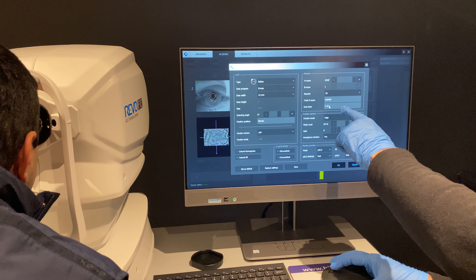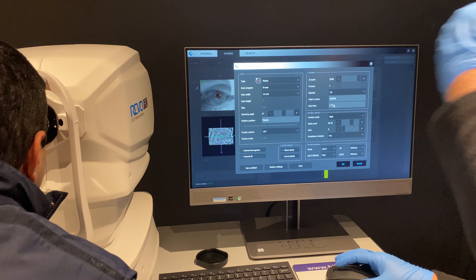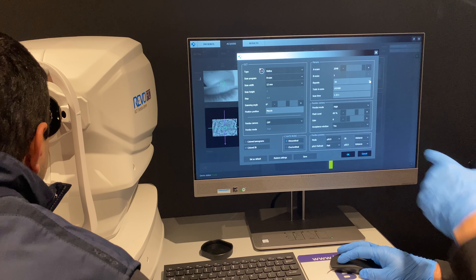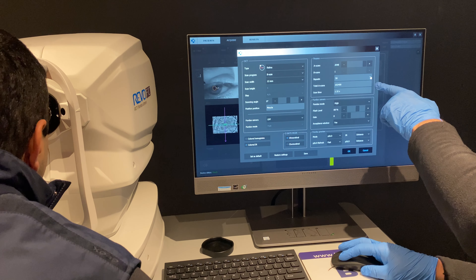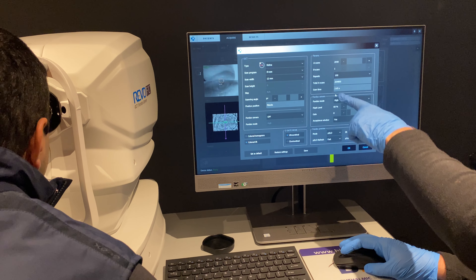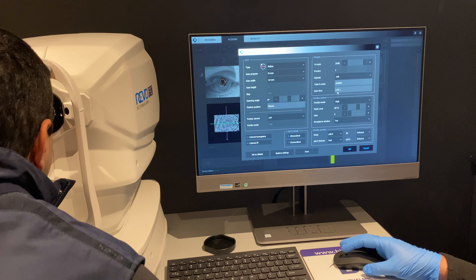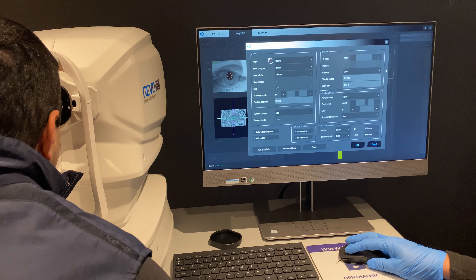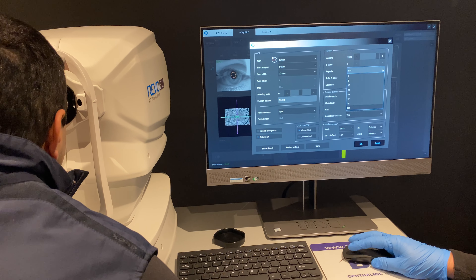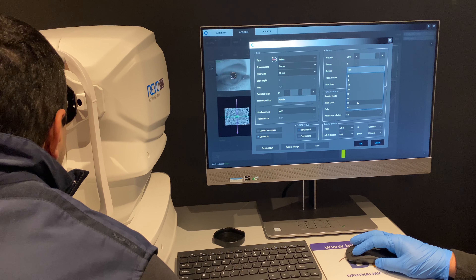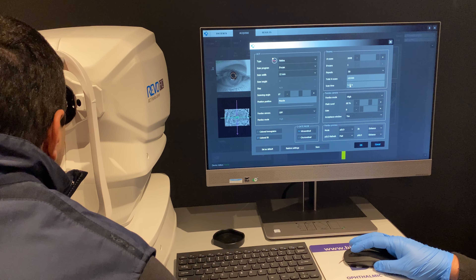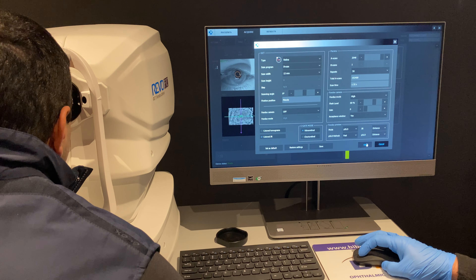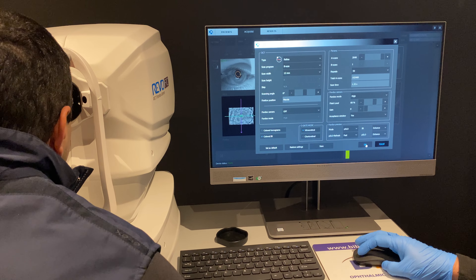It's going to do the B-scan 50 times to give us one image, and it's going to take 1.32 seconds. For the highest possible definition you could increase the repeats to 100, but then you're asking the patient to fixate much longer. The default is 50 because most patients can fixate for 1.32 seconds. I'm going to press OK.